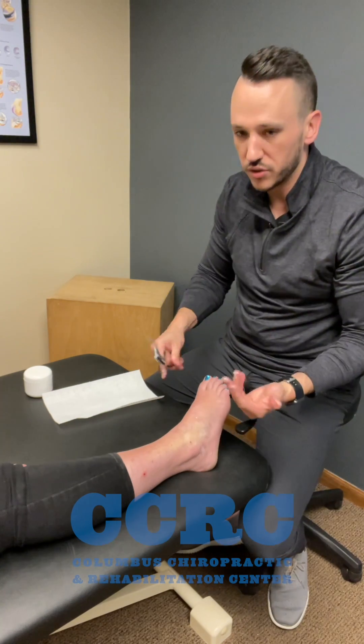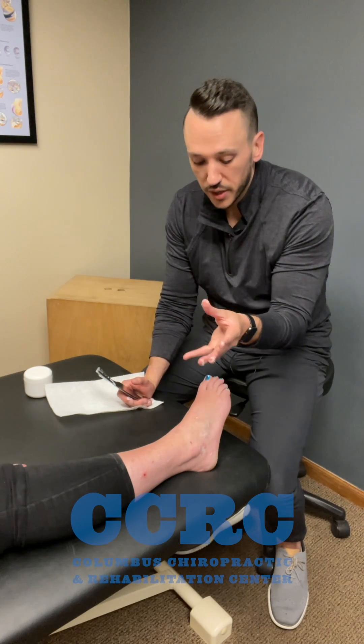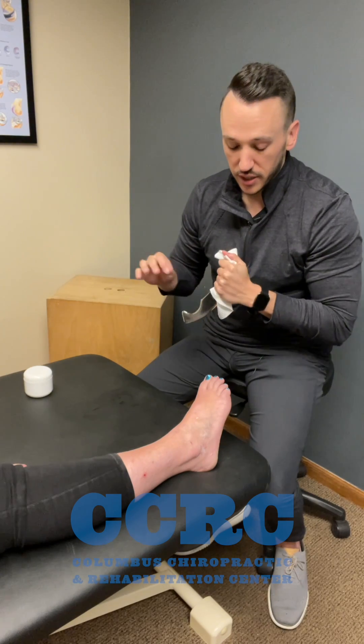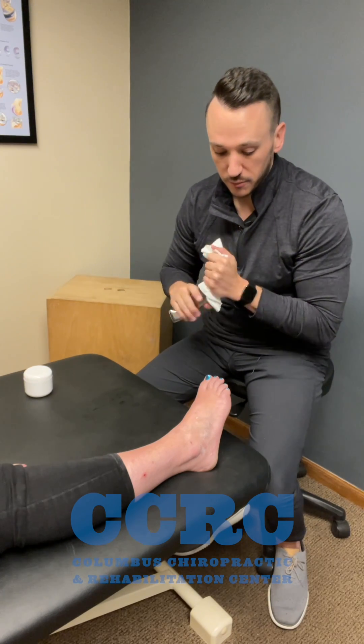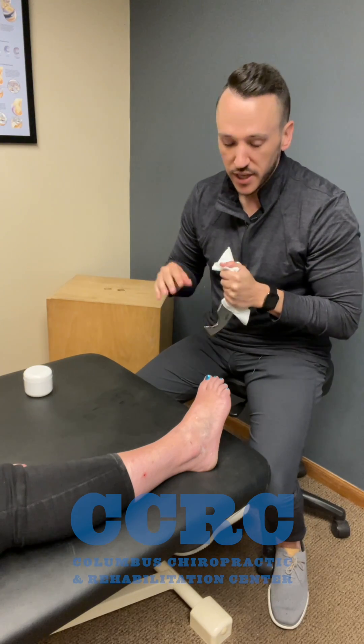I may do this for a couple more minutes in a real case. What that's doing is helping the movement of some of that inflammation up and out of the ankle, so that will make the rest of our treatment that much more beneficial. I hope that sheds some light on how we may use these tools in treatment of lateral ankle sprains. Keep an eye out for the other videos to learn more about some of the other tools that we use. Thanks guys.